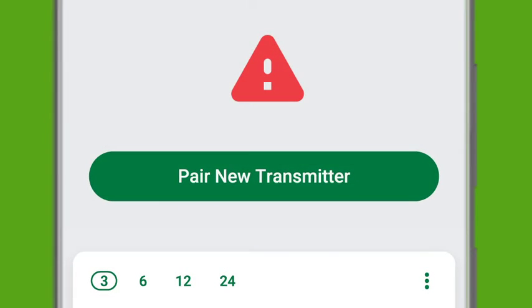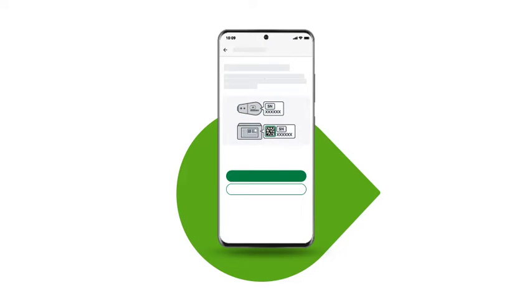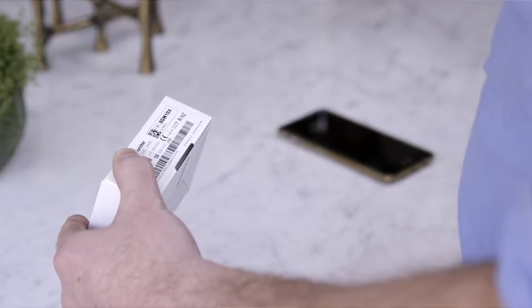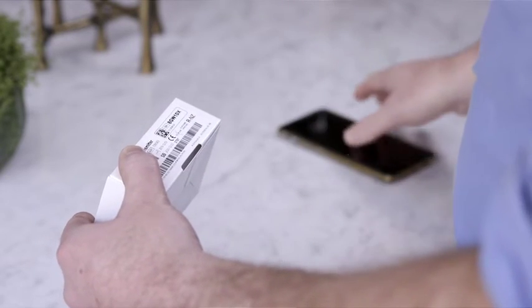After removing your sensor and transmitter, tap 'Pair New Transmitter' in the app. You will be prompted to enter a new transmitter serial number. The serial number is on the outside of your transmitter box. Enter the number by taking a picture.